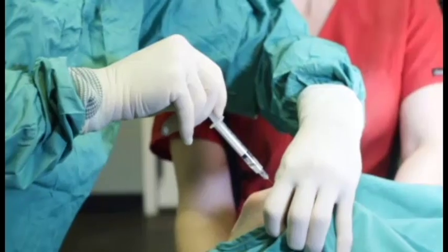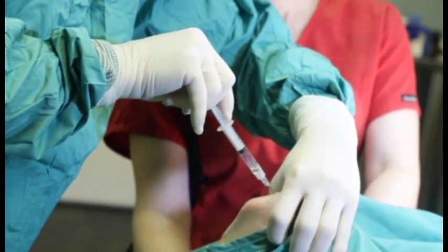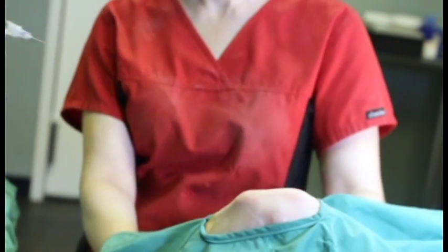Holding the syringe with the needle attached, pass through the skin, joint capsule, and synovial membrane. Attempt to avoid articular cartilage, but if encountered, back out slightly with the syringe or simply release pressure. If bone is encountered, simply retract and redirect the needle. If synovial fluid collection is intended, aspirate in a gentle and slow manner once the needle is in the proper position.